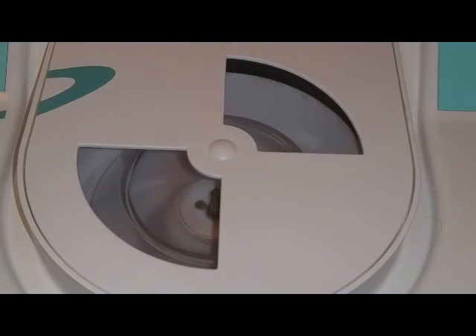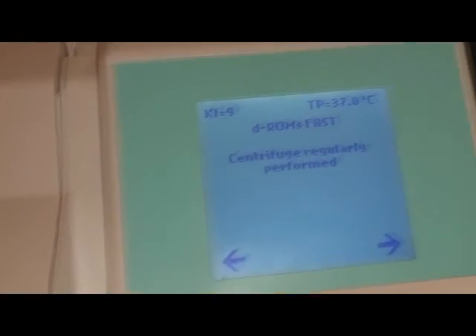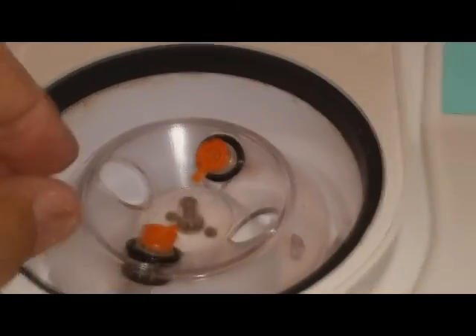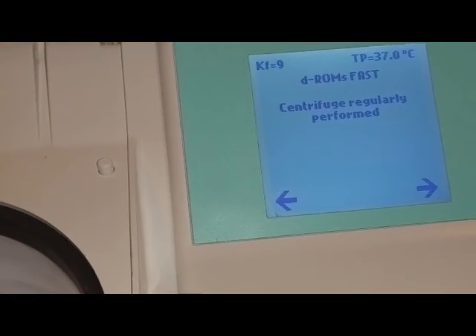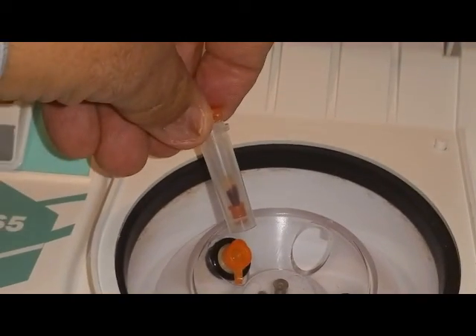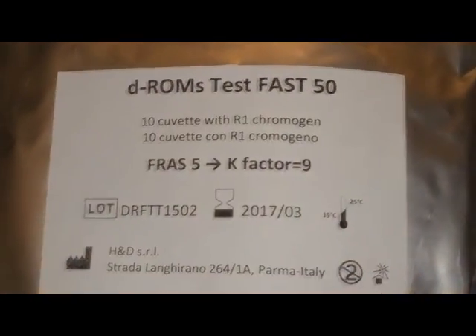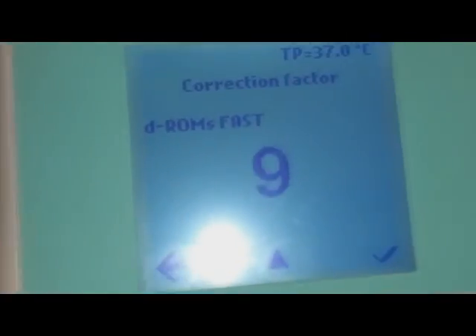The centrifuge is spinning down and we get a message saying it performed okay. Now we can open the door, take out our blood sample — not the balancing tube — and you can see it's spun down so you have plasma separated. Now I'm going to check the kit to confirm it's calibrated properly. We're doing the DROMs fast 50; the factor is 9. Yes, it is in fact 9, and it remembered it from the last time we did the test.